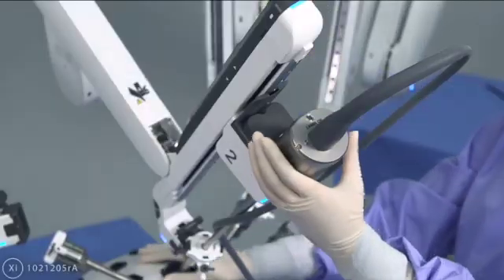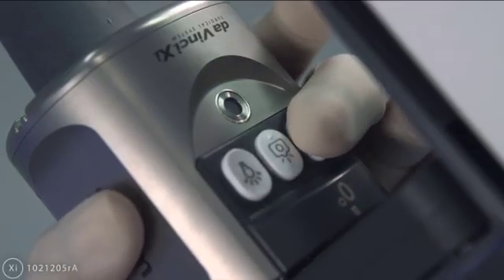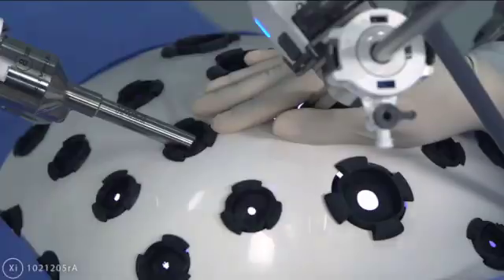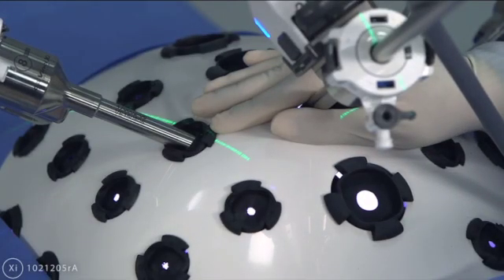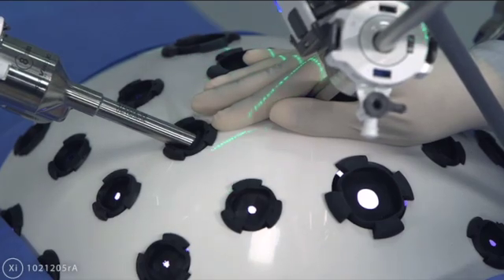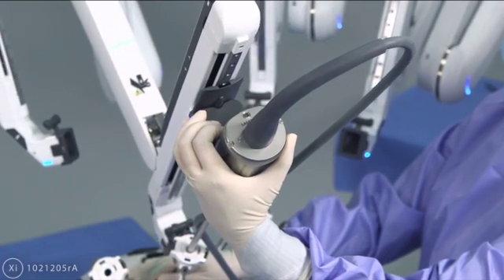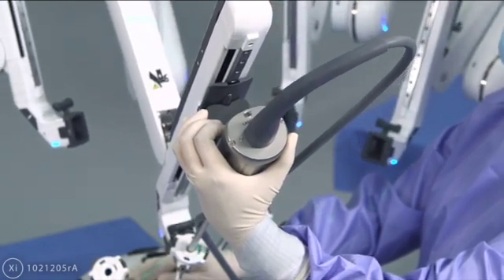While stabilizing the cannula at the patient's body wall, he or she presses and holds the targeting button on the endoscope. During targeting, the system positions the boom over the initial endoscope port and orients and positions the boom to maximize range of motion and create adequate sterility clearance between the draped arms and the non-sterile boom.